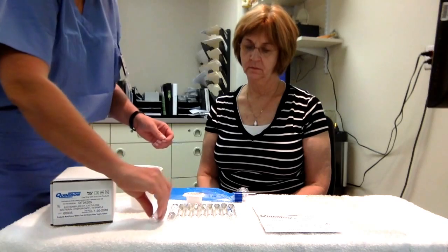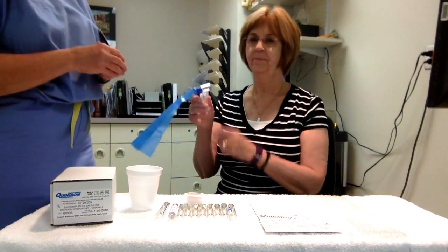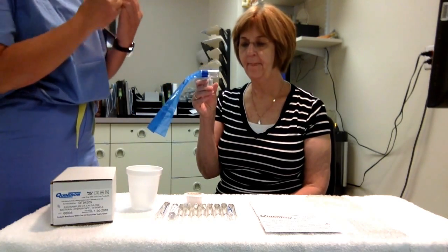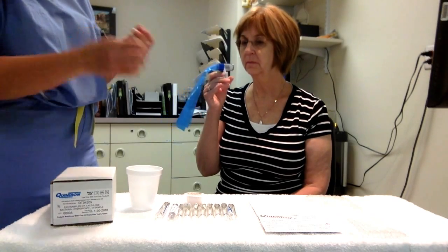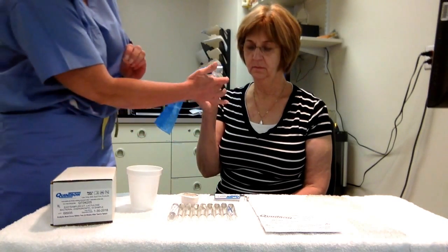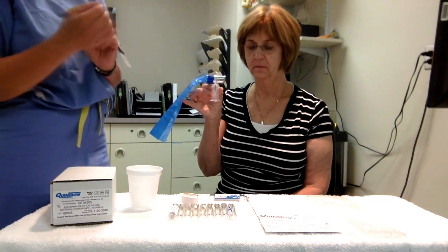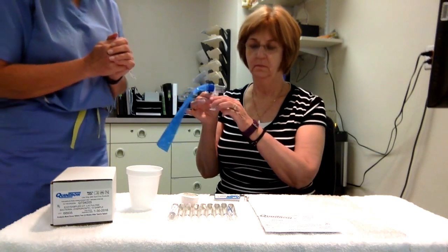Bev is going to demonstrate how to get a sample. Bev, if you'll take the device — what I'd like you to do is, when I ask you, take a normal breath in and then put the device in your mouth and slowly breathe out into the bag. Once you breathe out into the bag, you're going to take this sample and puncture it into the tube underneath.